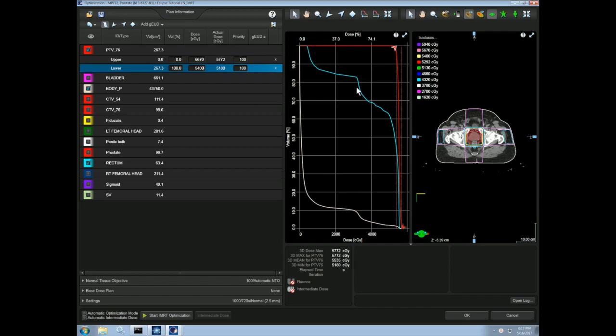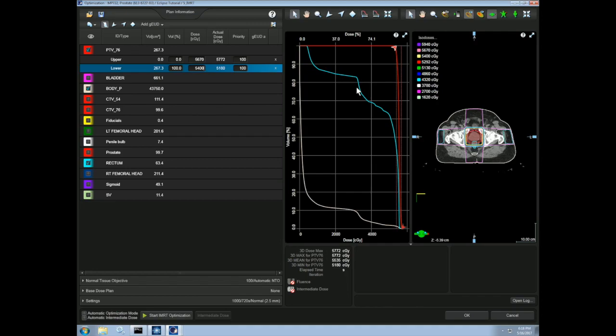Let's now add some critical structure constraints. For this video, we will add constraints on only the bladder and the rectum for simplicity. The critical structure constraints are often specified by the physician based on clinical experience. There are also many Quantec reports that specify DVH-based probabilities of complications for many normal tissues. As I mentioned earlier, we will only want upper constraints for the critical structures because we want to always ensure that we are getting less than a specified dose to the critical structures.